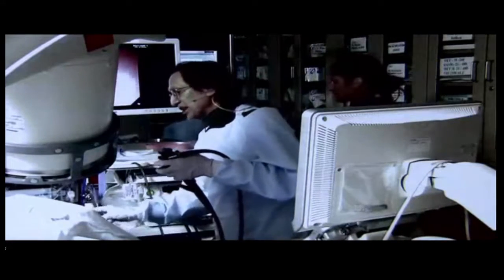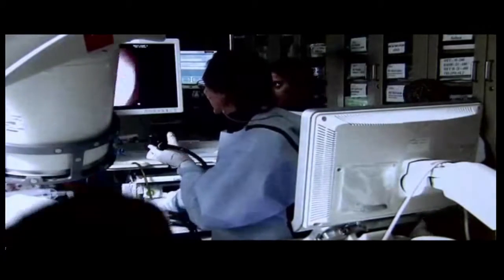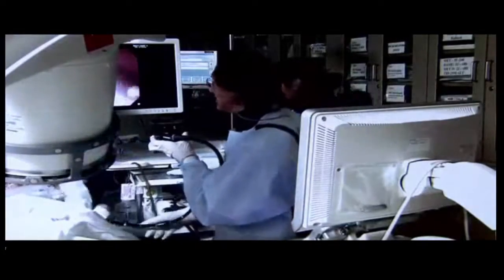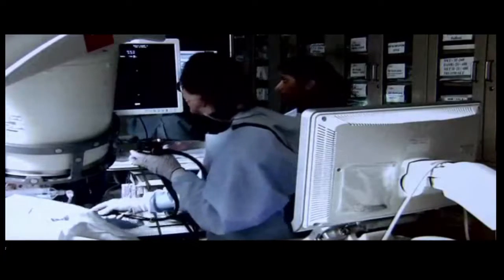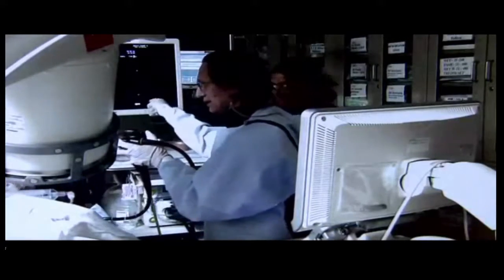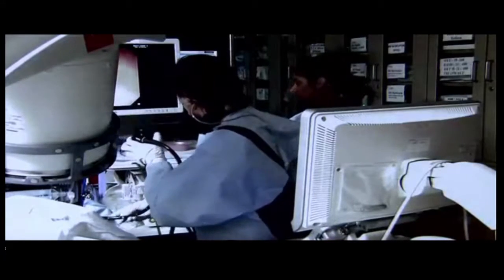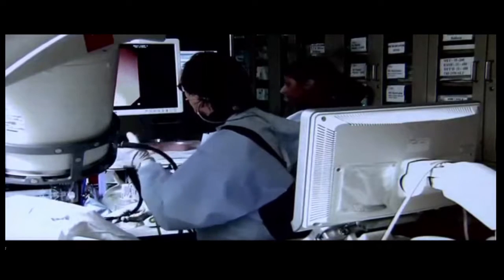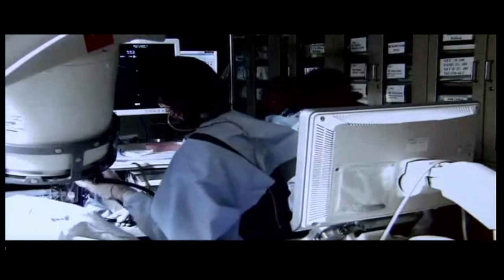So that water jet channel, what the forward view doesn't have is a balloon at the tip. There's a plus and minus to that. The minus is if you're in the duodenum, sometimes we use that balloon to anchor ourselves when we go into the short position. Oh yeah, now we have the image. So this is working. I do need a little endoscopic view though, so I know where I am. Here we go, yeah. I'm sorry, you did have it for me. You want that? Yeah, back, yes, sorry. All right, so you'll just see my back then, so I apologize.